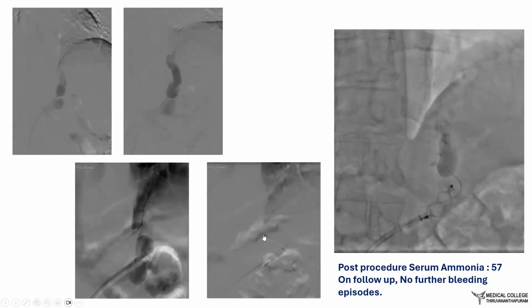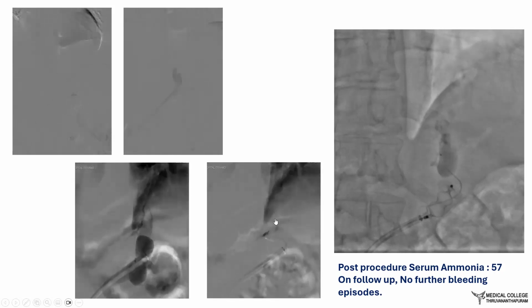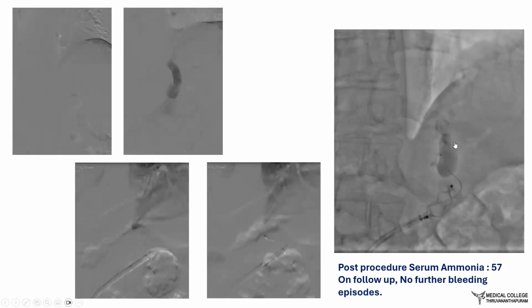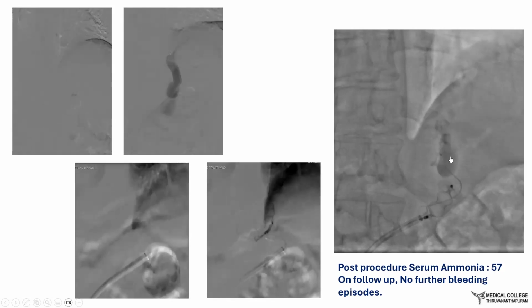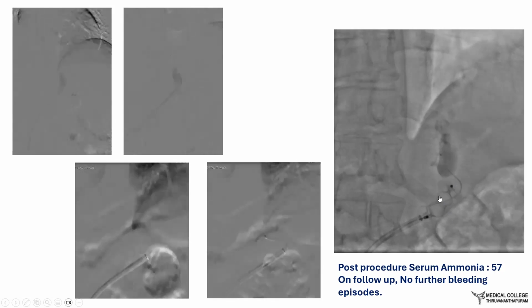So this patient had a bilateral phrenic vein as well as some lumbar veins, which were selectively cannulated after passing our long sheath using a microcatheter, and embolized using a mixture of gel foam and PVA. Before we put in the sclerosant, we placed a vascular plug. Now this we used an AVP device. This was also one of the initial cases that we have done. Lately we have changed our hardware. I'll just run you down what are the changes that we are now using in our place.